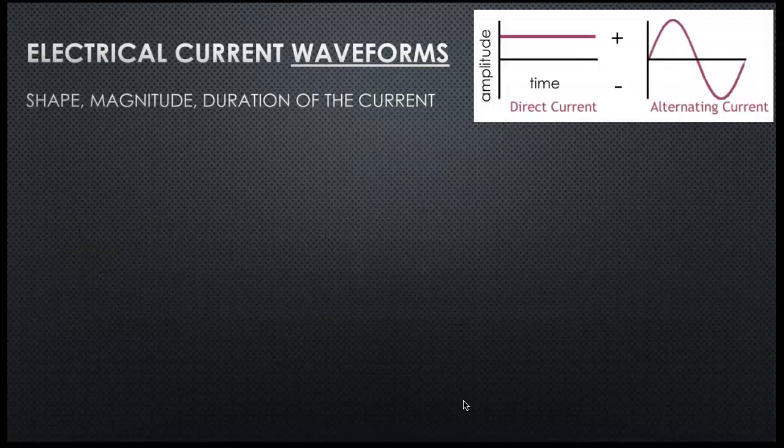All right, so there's different types of waveforms. All those names of electrical currents are typically describing the waveform, and it's just the shape. Like if you think about an XY axis, above the x-axis is positive and below is negative. That's the shape of the waveform, and what it does is described by what it looks like on the XY axis.